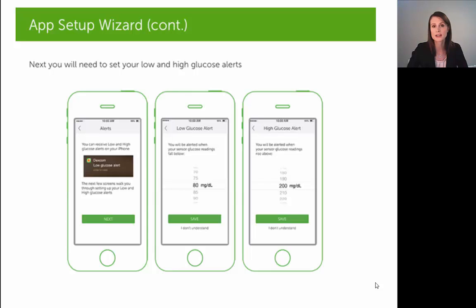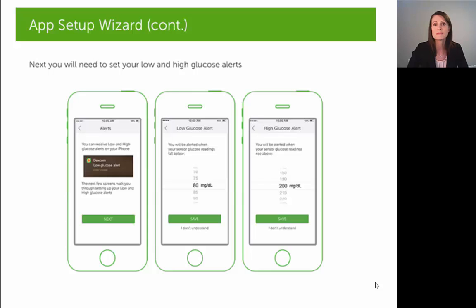You can keep the high alert at 200 or you can modify it. Some people choose to set their high alert at the upper limit of their target glucose range, like 180 or 200, but others feel that would alert them too often and choose to raise it — perhaps to a level where they should consider checking urine for ketones. These are completely modifiable and you can change them at any time. It's helpful to get guidance from your physician when determining where to set your high and low glucose alert.